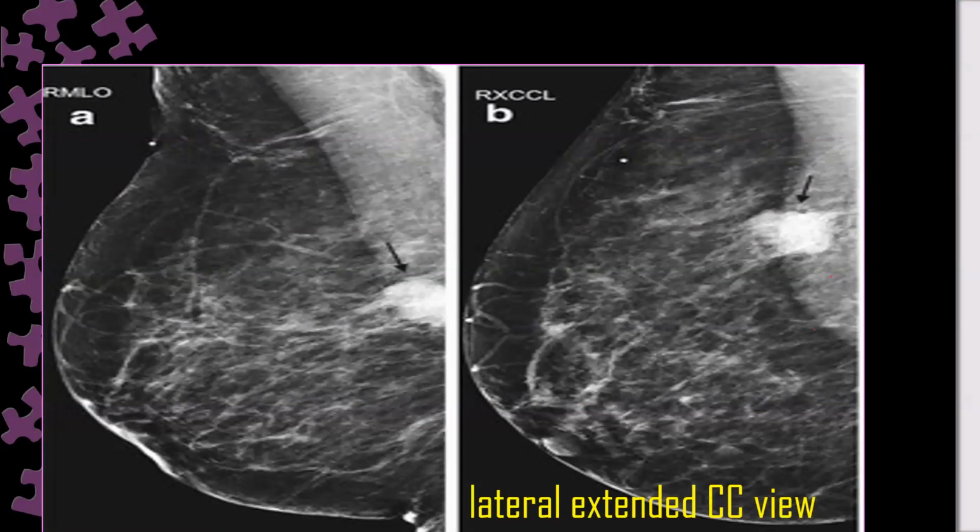That is why it is not a lateral view. If it is a lateral, you might not even see this lesion or see just a smaller portion of it, the anterior portion of it. Because usually, even the pectoralis muscle on the lateral view, you will see it smaller than the pectoralis muscle on the mediolateral oblique view. Agree? Yeah, agree.